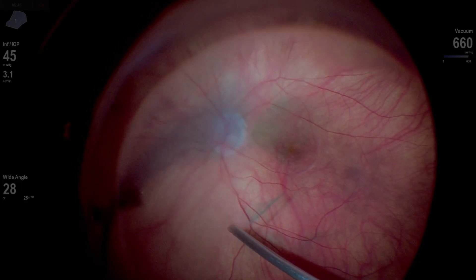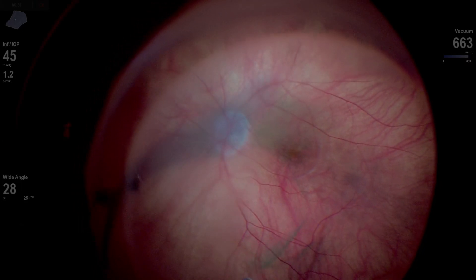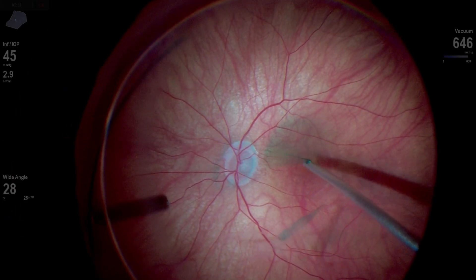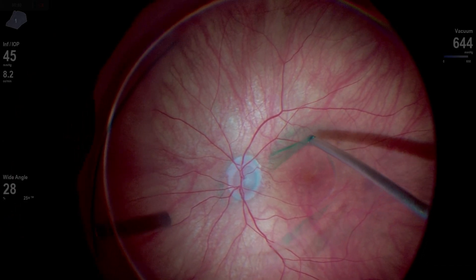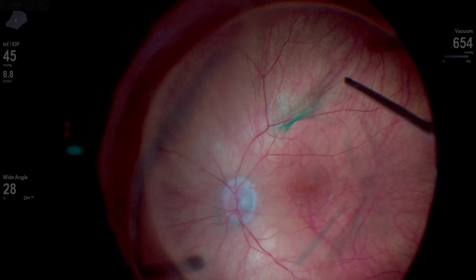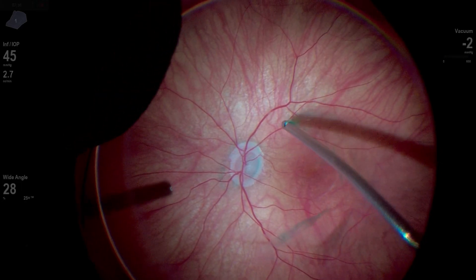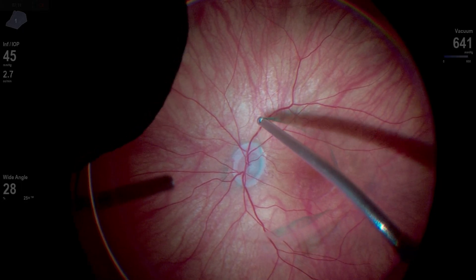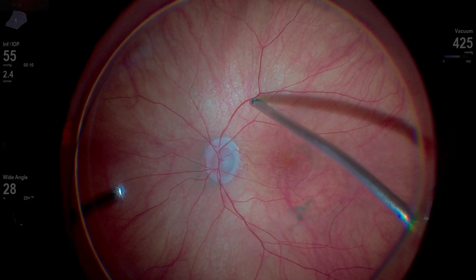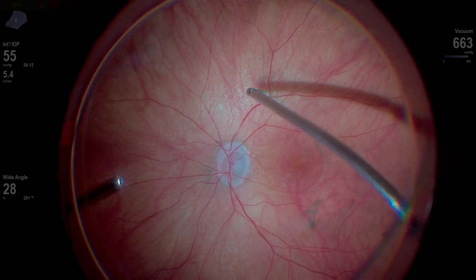And then finally you'll see I'm able to actually elevate that hyaloid with this move right here — up and out along the arcade. And finally we have some separation. Once you get that first edge up, you can come back and get under the edge of the vitreous. I'll use my cutter with aspiration almost like a pick to try and help elevate it. Very attached posterior hyaloid — this patient had vitromacular traction, so it was a tough one. We just kind of go around and try to free up that vitreous and elevate it anteriorly.